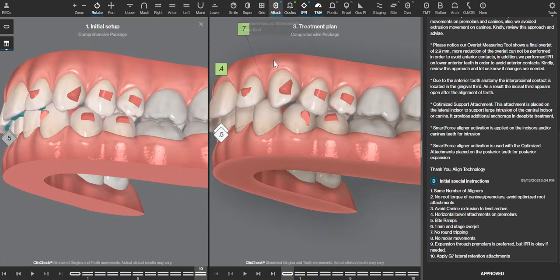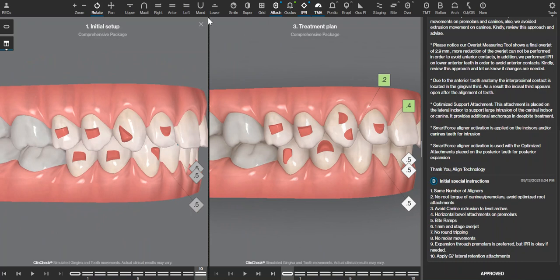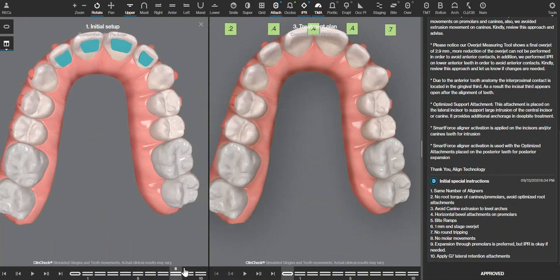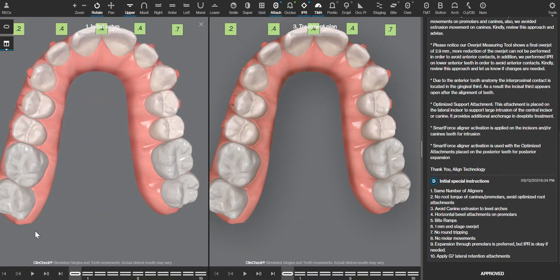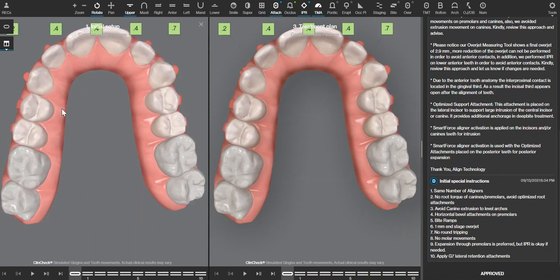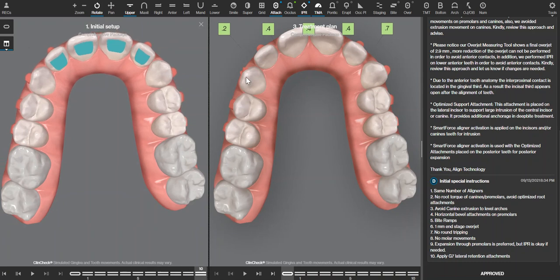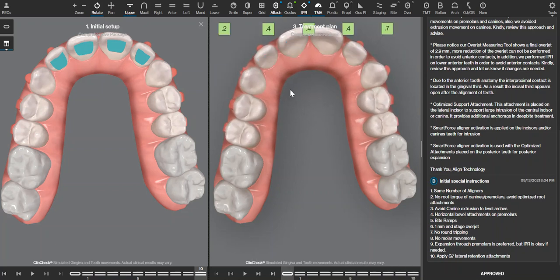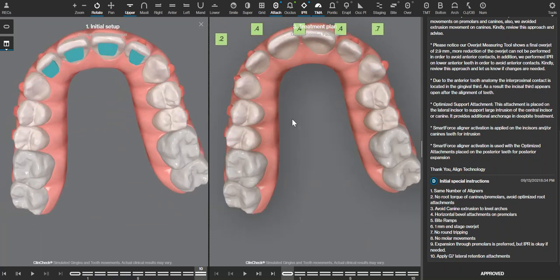Looking again at the attachments that we have planned, some of the premolars are rotating, some should, some shouldn't. So when we look at the upper arch, these premolars, we'll take a look at number 4 for example, is occupying more space mesiodistal in its starting position than if the rotation gets quote unquote corrected. When this gets corrected, it occupies less space in the arch, which very subtly but does increase how much space has to be left distal to the canines. So one thing that I would have liked to have done is eliminate the correction of rotation on the upper arch, and so then these retention attachments would be appropriate.